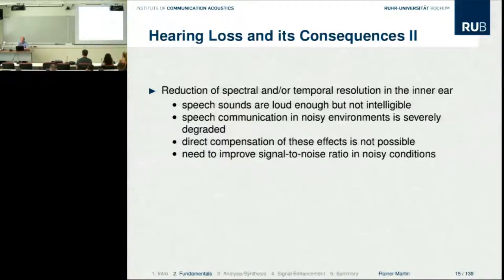That essentially means that speech communication in noisy environments is severely degraded, because the ear cannot tell apart the target signal and the noise. It's all mixed together, and that means that your ability to understand speech in noisy situations is severely degraded. Unlike the elevated threshold of hearing, which you can compensate by amplifying the signal, this is an effect that you cannot easily compensate. There's no inversion, so that you can run your acoustic signal through the inverse system and then cancel these effects. So no direct compensation of these effects is possible.